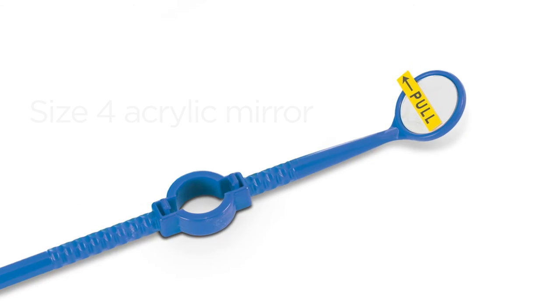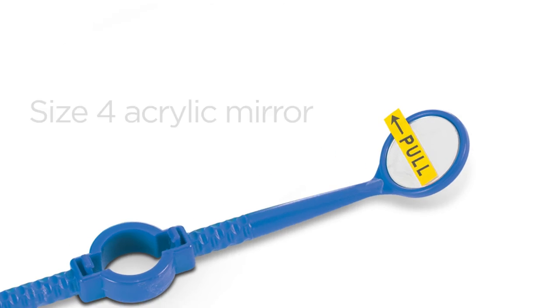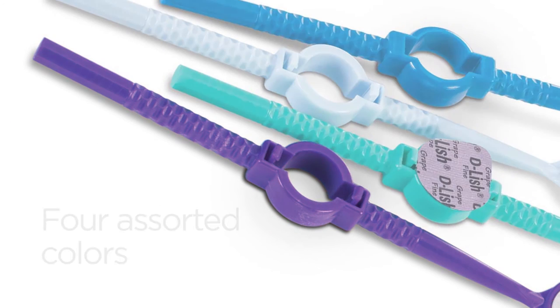The Versagrip mouth mirror also features a size 4 acrylic mirror and a knurled non-slip handle in four assorted colors.